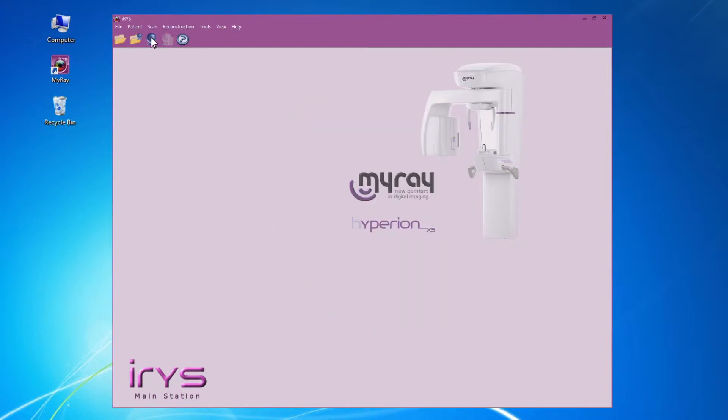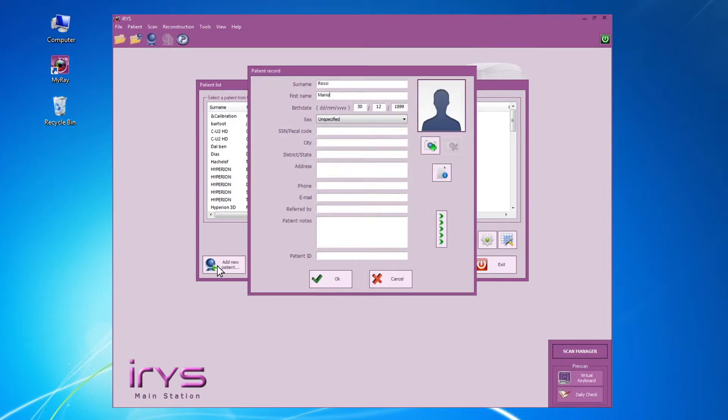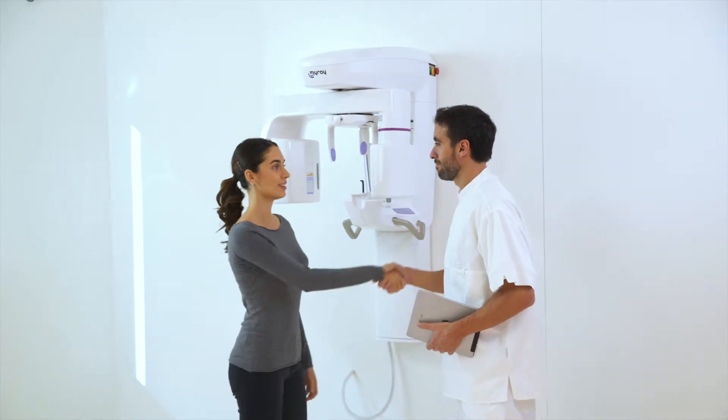Before the examination, the dentist selects the patient's personal profile from the database. Then he chooses an examination protocol on the virtual console available on PC and iPad.